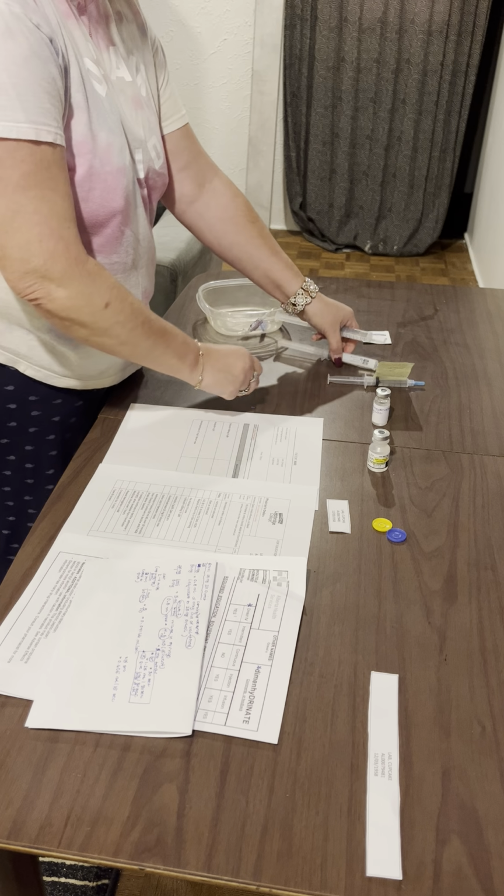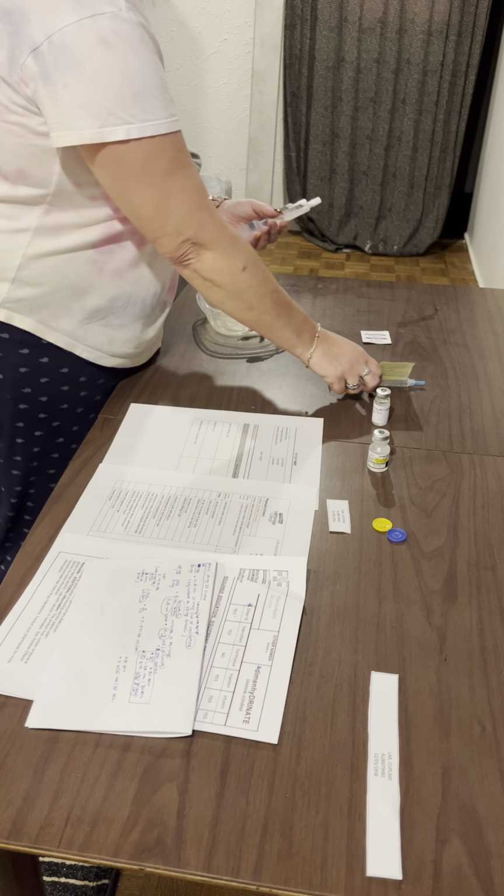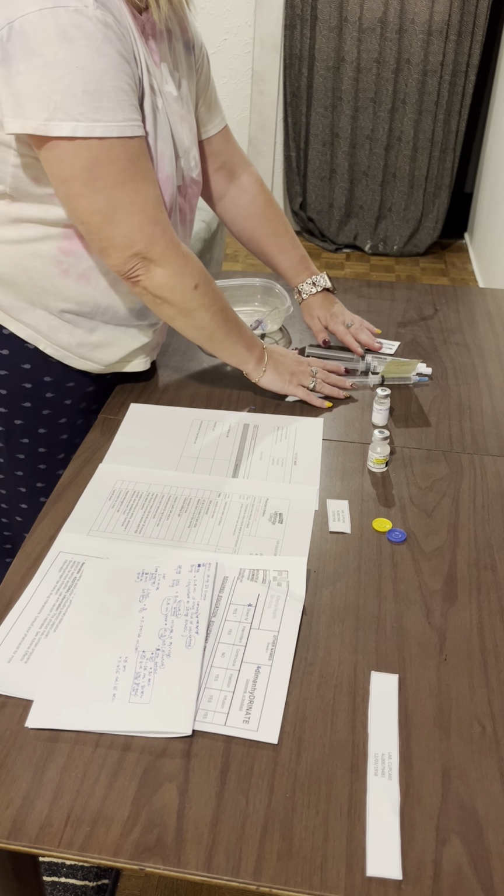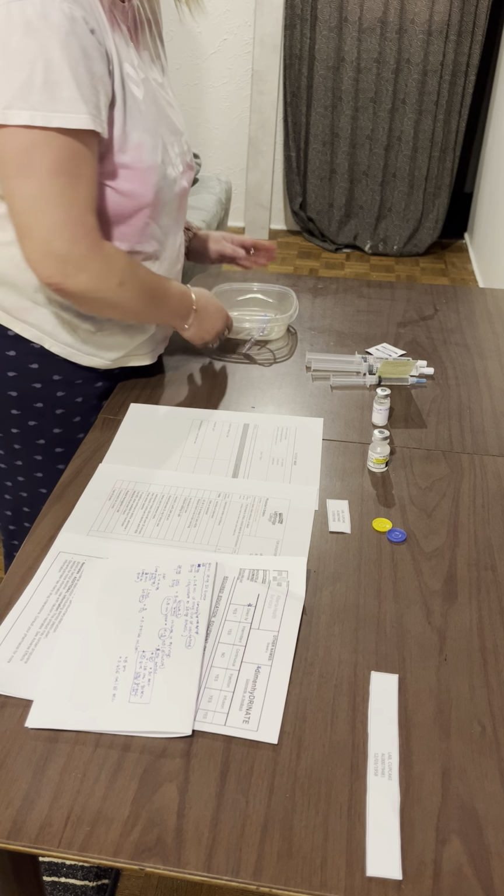And actually, no, I prefer to leave the caps on. I do want to leave the caps on until we get to the room. That is just, for me, safer practice and my preference. Okay, so now we have the medication. We have the 2 syringes. We have an alcohol swab.